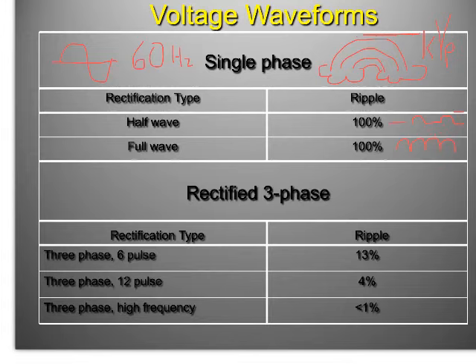And I'm also pulsing those guys, right? And what that means is the waveforms, they're out of sync, and I'm also pulsing them 6 times, which again, I'm just flipping them over the line, right? So I've just doubled and then doubled down on the process. So this is fairly difficult to draw, and I don't really have space to draw it here. I am going to draw it right here.